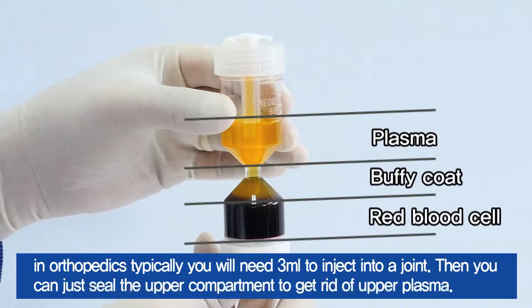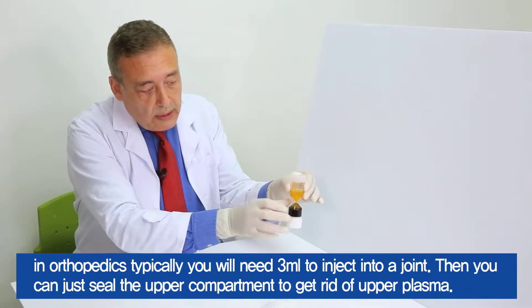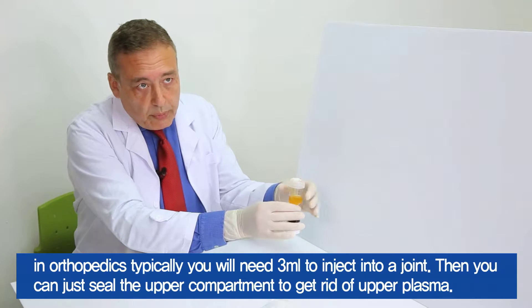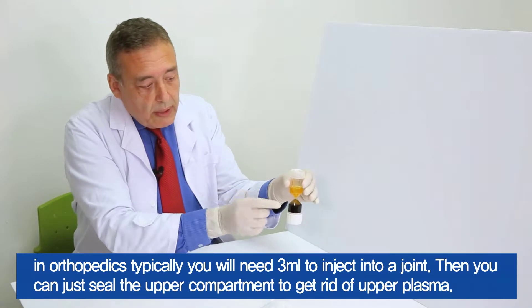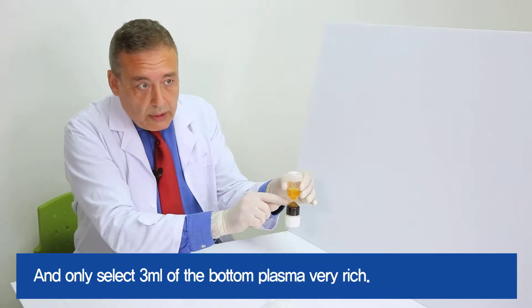In orthopedics, typically you will need 3 ml to inject into a joint. You can just seal the upper compartment to get rid of the upper plasma and only select the 3 ml of the bottom plasma, which is very rich.